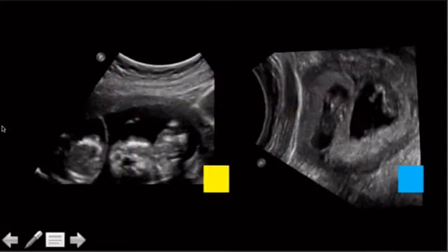All right, so twins. Just a quick twin thing here. I think I have this in my case book or Crack the Core, can't remember. It's in one or both. But basically it's the difference between this thing, the T sign, and that thing, the twin peak sign. The difference is, the T sign is just a thin membrane. The twin peak sign is the piece of meat. So the T sign is basically the absence of the twin peak sign.